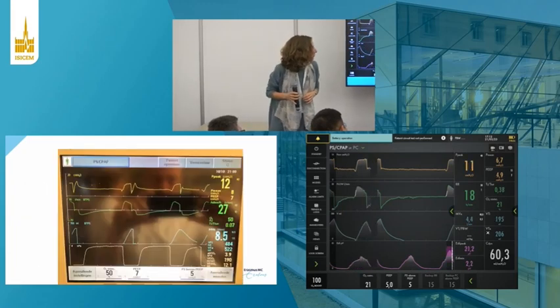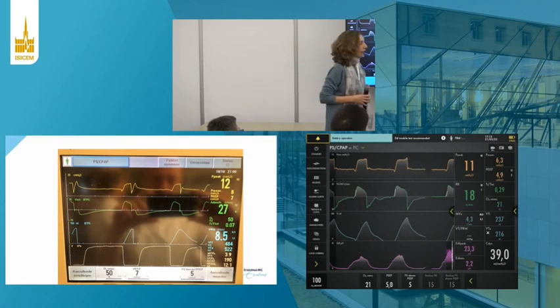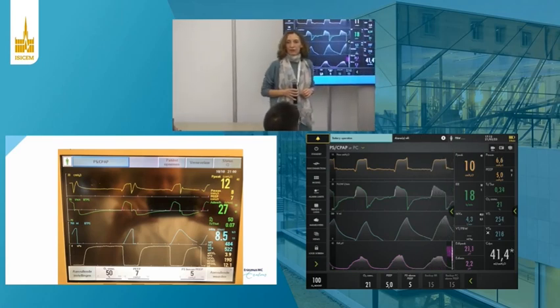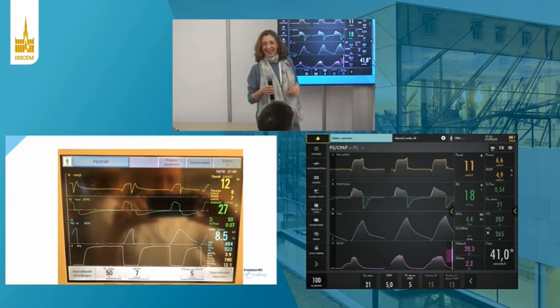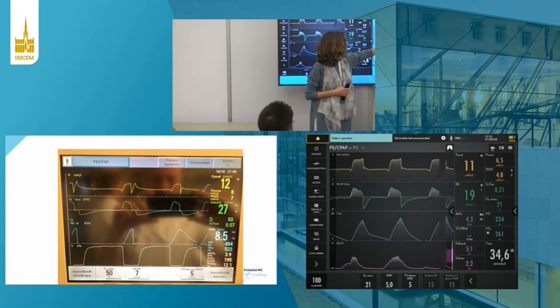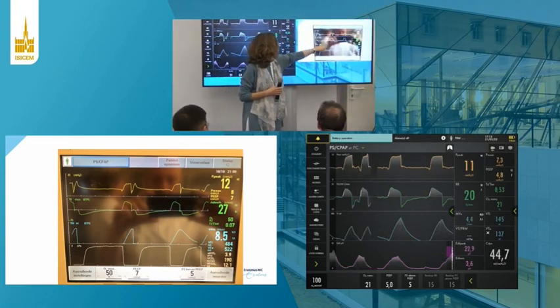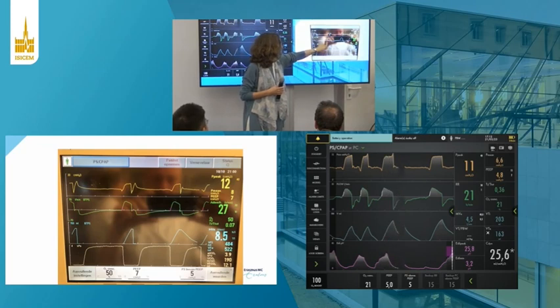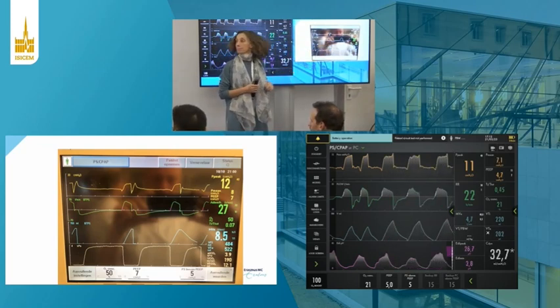So you've discussed this, right? So go ahead. Okay, so this is the opposite of ineffective effort. This is when, what do you see? Clearly see? Yes, it's clearly a double triggering. We don't have the muscle pressure, and we don't need anything else to identify that the patient here. So can you just wait one second, so everybody could hear it. So this was double triggering.